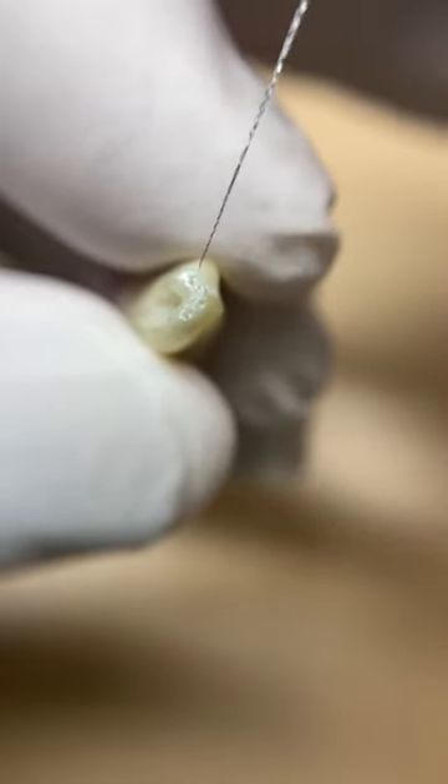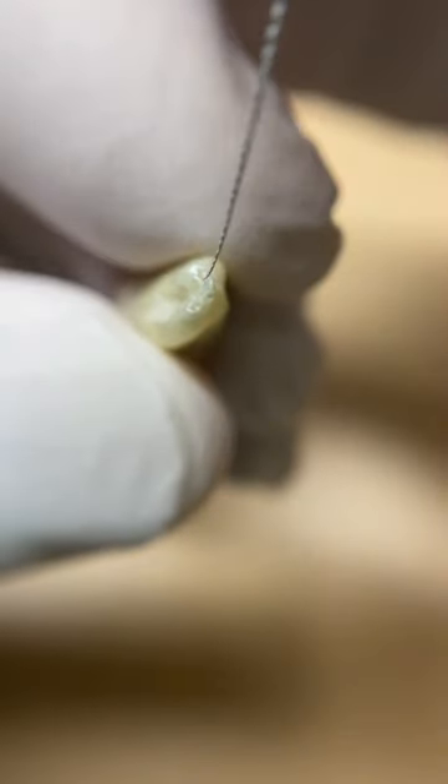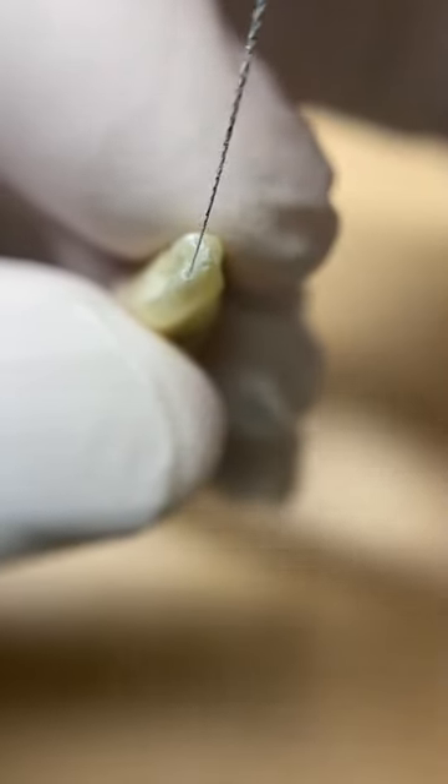It looks like we have a main canal here — let's see if we can get our file in there. We also have a couple of accessory canals, one there and then one here.